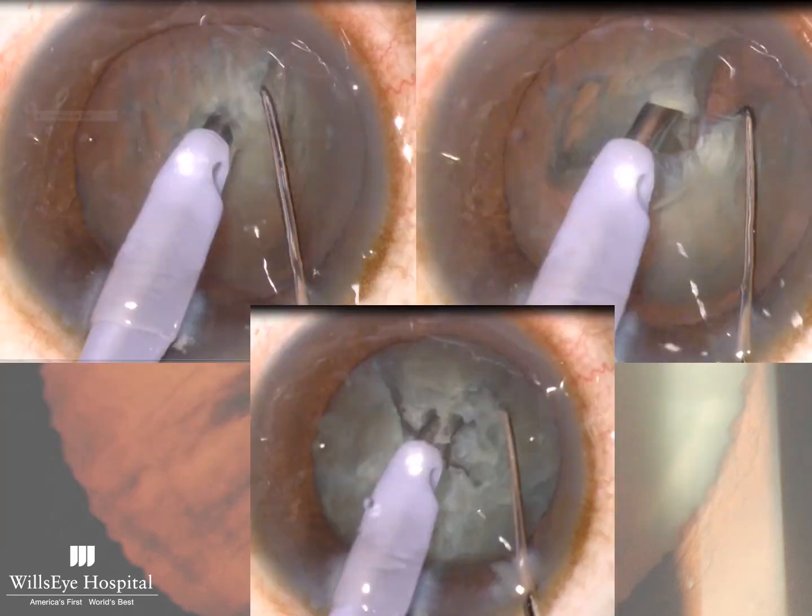So this is a schematic of a vertical quick chop technique. Here I am embedding the phaco tip into the nucleus. I'm dropping my second instrument distal to it, and then I pull towards the phaco tip to create a cleavage plane, and then I move back and I start to spread. And so you can see that I've got a nice crack forming here. And then I rotate, that's my initial crack. I'm phacoing into the material and dropping my second instrument down here again.